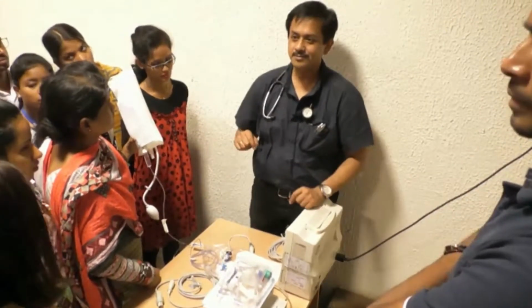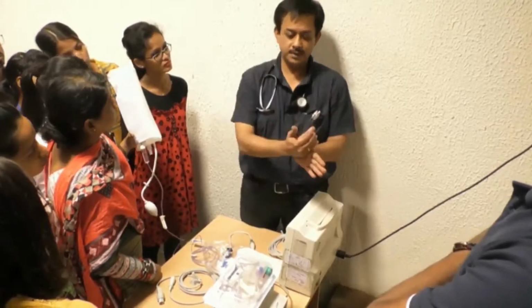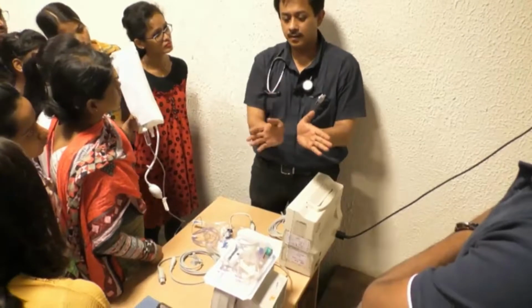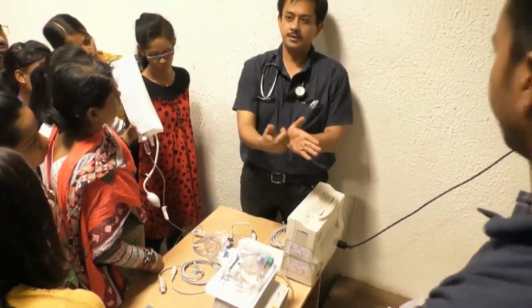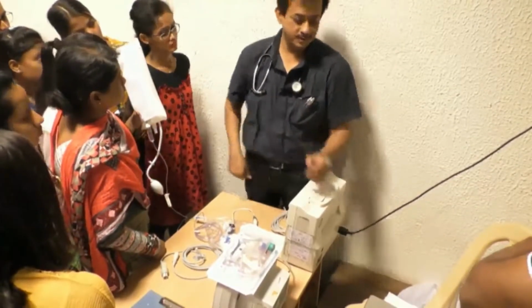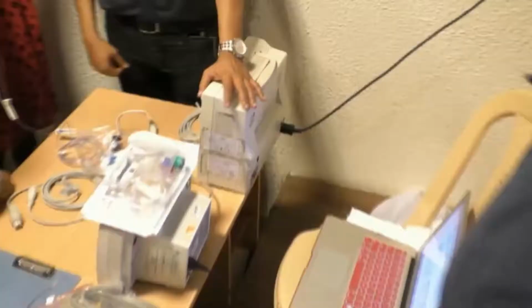What do I do? No, your leveling is done, by leveling you fixed the position of the transducer, your zeroing is done, with that now you are monitoring the patient's blood pressure. Leveling done, zeroing done. What do I do next? I showed it. Flush test or square wave test. For that, what do we do?